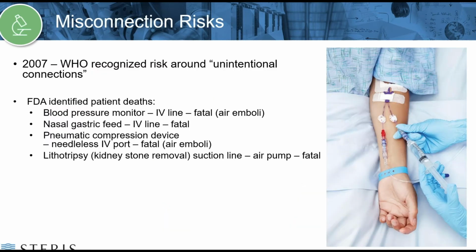So on the left, we have a female slip connector and a male slip connector. These are far less common these days, where the lock connectors are generally the most popular design to employ.